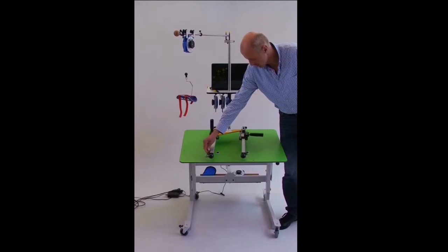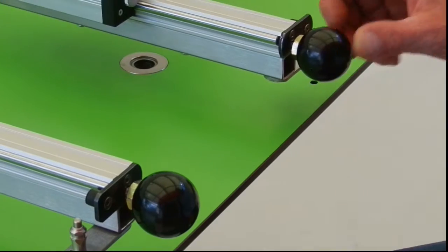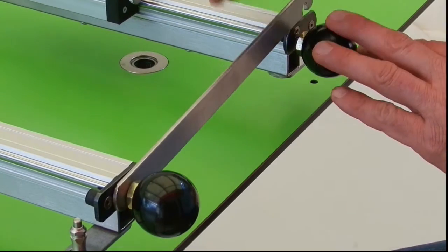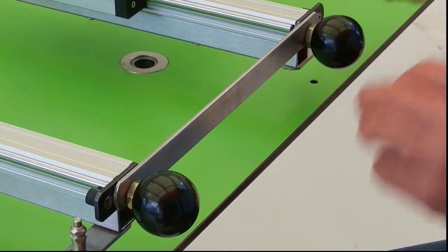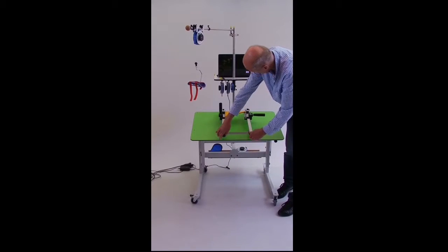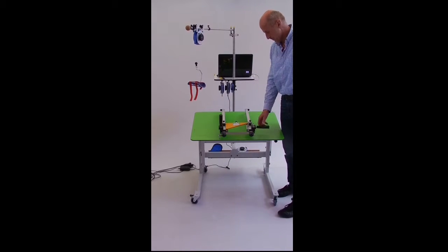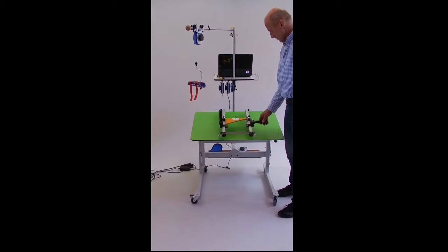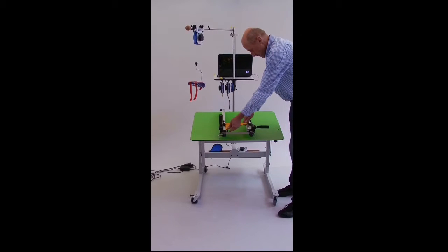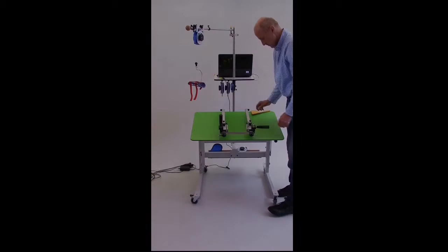To fix one swivel arm, it is necessary to put the bolt into the tabletop. To fix both arms, it is necessary to put the clasp behind both spheres. The lateral movements are not possible anymore. The healthy arm can now move the affected arm back and forth. When the yellow triangle is taken away, the arms can act independently.